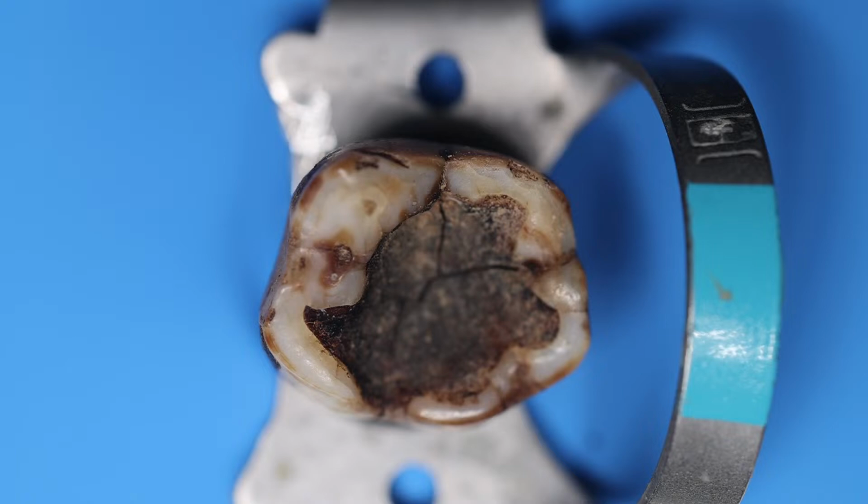This is a live demonstration on access opening. There is a deep caries involving the pulp, and this decay has progressed to the pulp, so we planned to do a root canal treatment, and for that the first step is access opening. So we should learn the basic steps of this access opening.